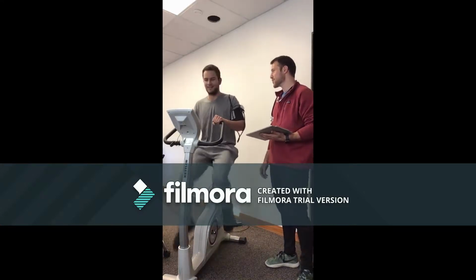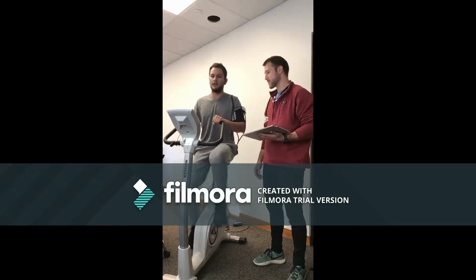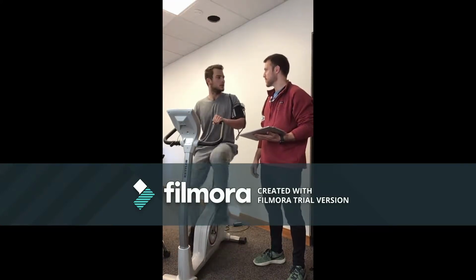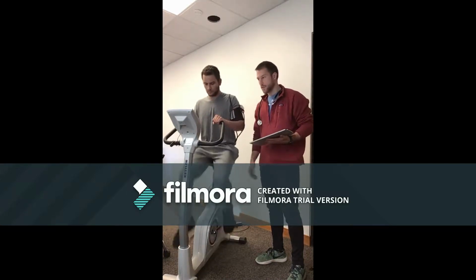I'm your student PT. For today we're doing the Astrand test. It's a submaximal test. We're hoping to estimate your VO2 max. We're going to get an assessment of aerobic capacity. So we've had you going for your warm-up here.